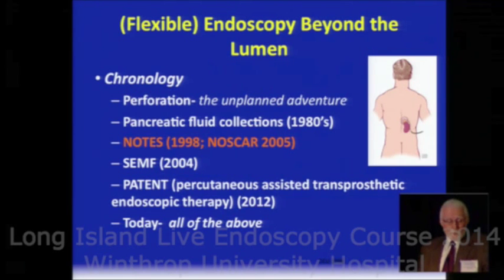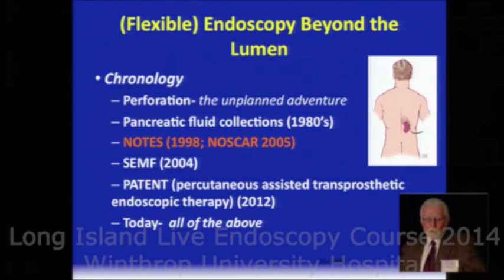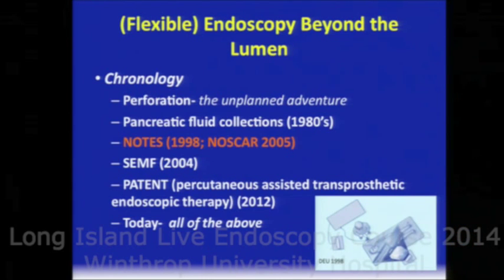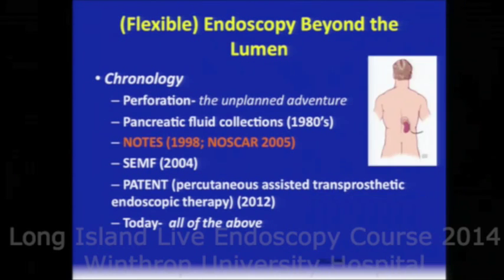And finally, today we're doing all of the above, including full-thickness resection, as Stavros had mentioned. When we opened up the developmental endoscopy unit in 1998, this was the concept drawing that I gave to all my fellows, and I said, this is ultimately where we want to be. As you notice, the endoscopist is standing somewhat similar to the laparoscopic surgeon. Both hands are free, working on or through the endoscope, doing transluminal procedures. We haven't totally arrived at that point, but boy, we are really close.